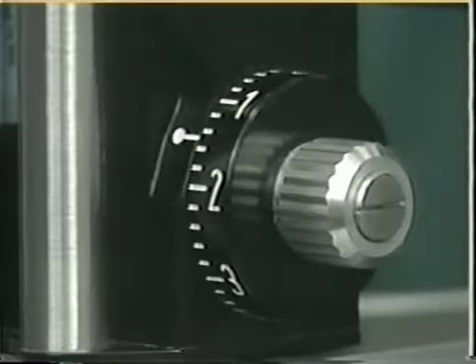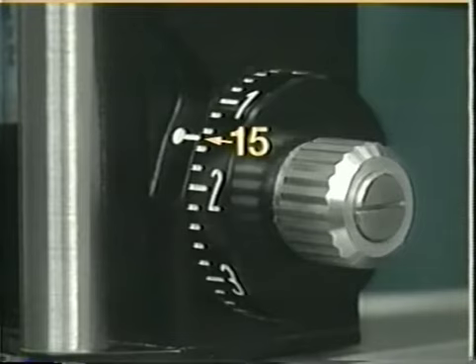The force of touch, or applanation, is adjusted until the inner edges overlap. Intraocular pressure is then read directly from a scale on the tonometer housing. The marks on the scale are in 2 millimeters of mercury increments, although intraocular pressure can be estimated to the nearest 1 millimeter. The scale number is multiplied by 10, and this corresponds directly to the intraocular pressure in millimeters of mercury.